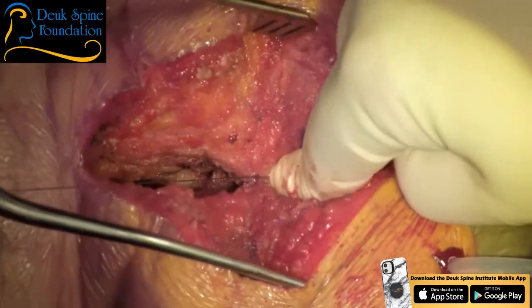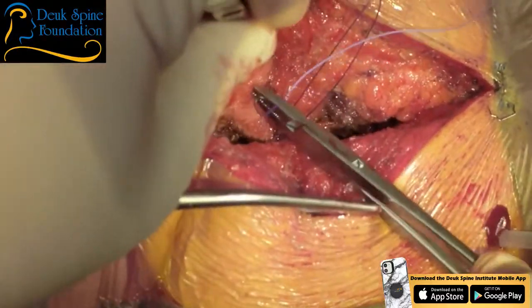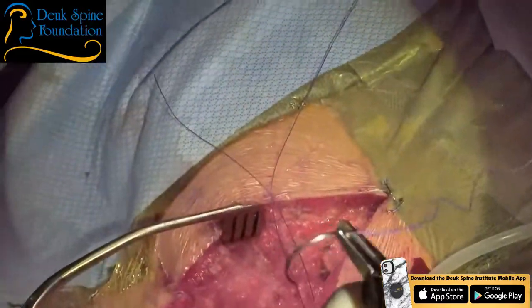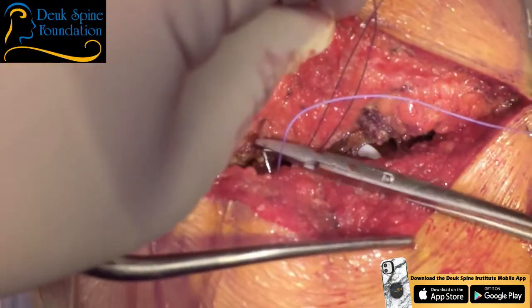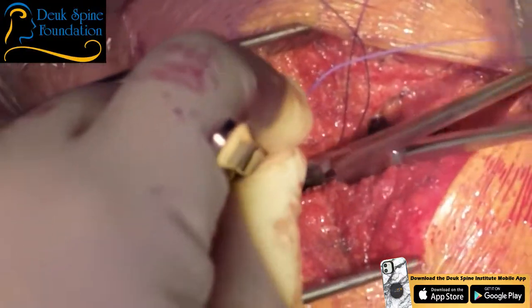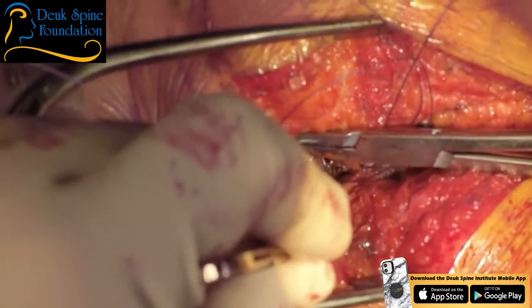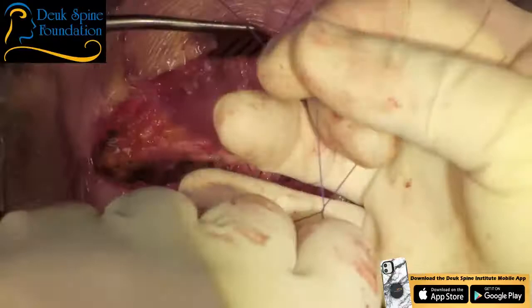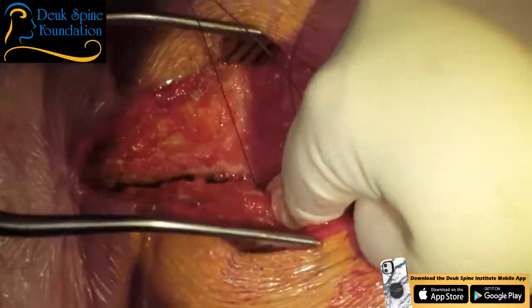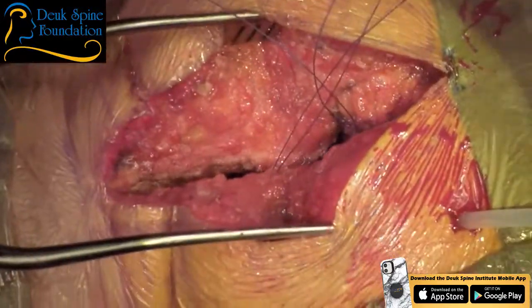You want to just make sure you don't sew that drain in, folks. It would really suck. Let's see if I can do it without this. So I'm going to go north of the drain for right now. My God. Good. It's so hard to get down there. Stay off the round part. Just stay on the flat part, okay? Yes, sir. If you sew the drain in, we'll be back again tomorrow to take it out. I've never sewn a drain in my career. I don't plan on starting today, but it's something you always have to think about.